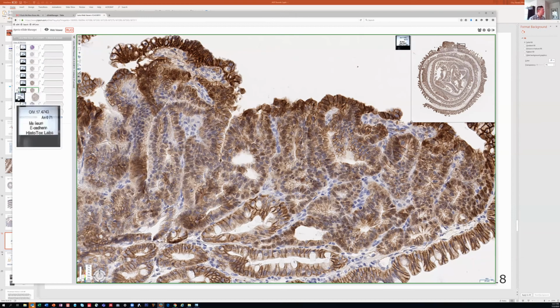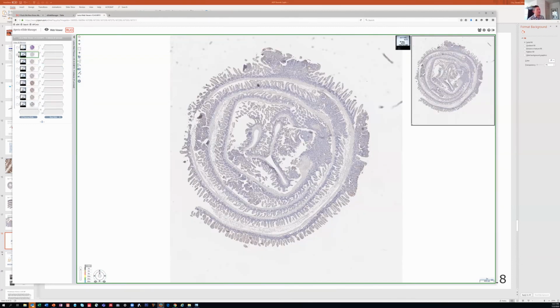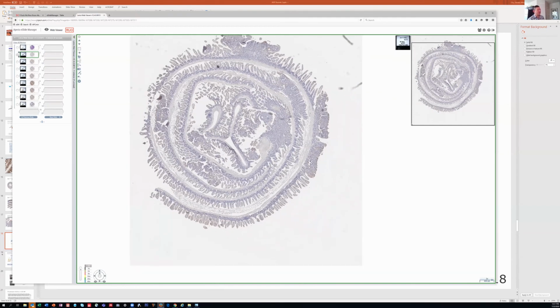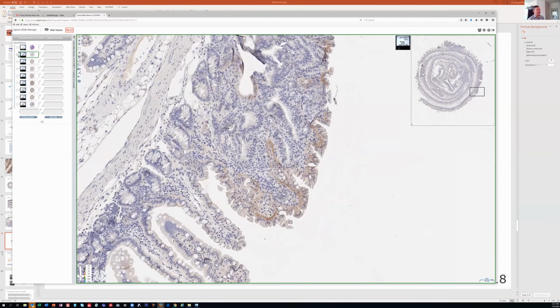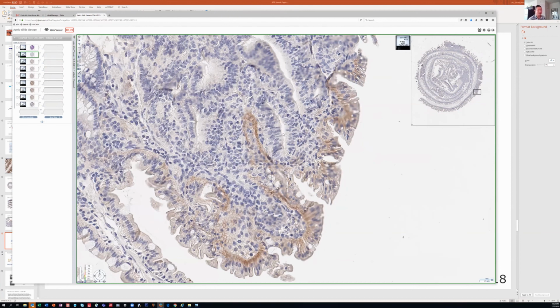Okay, so time is short, but I didn't believe this result until recently. And I've already shown portions of it. What I'm showing you is not chronologically correct. I first saw it for phospho-EGFR. This is the first observation that I made. And again, I was still at the level of, can I trust my antibodies? Is there a fixation artifact? Is this biologically real?